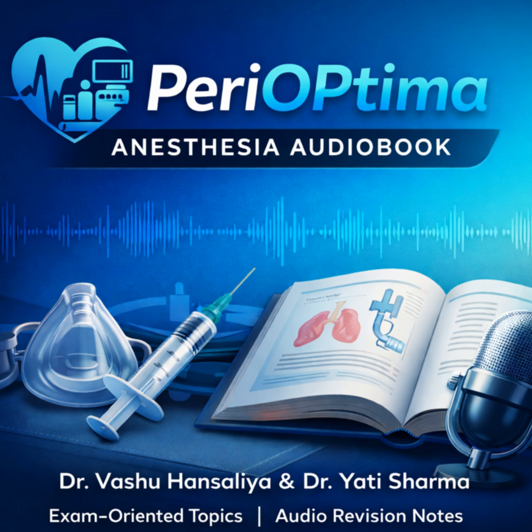Let's do it. We'll start with the absolute cornerstone question. Focus Q1. Describe the safety features in the anesthesia machine that prevent hypoxic gas mixture delivery. And the answer has to include the ratio regulator. It has to. The proportional linkage between O2 and N2O that guarantees a minimum FiO2 of 25%, even if the supply pressure drops.